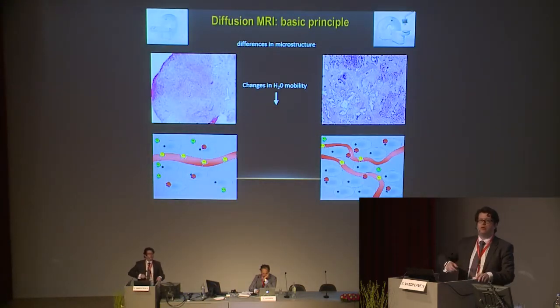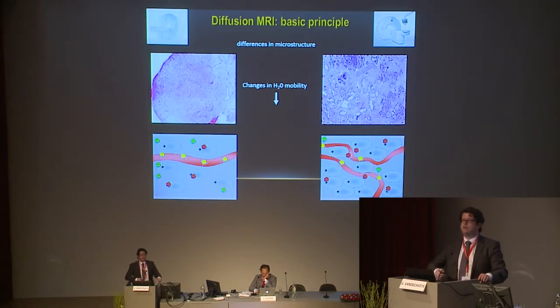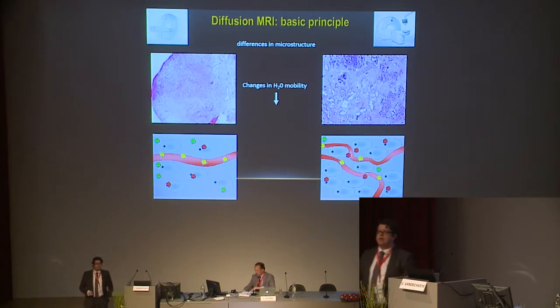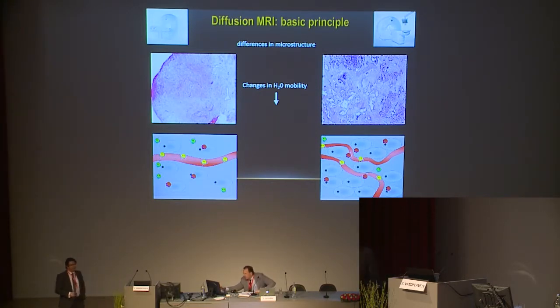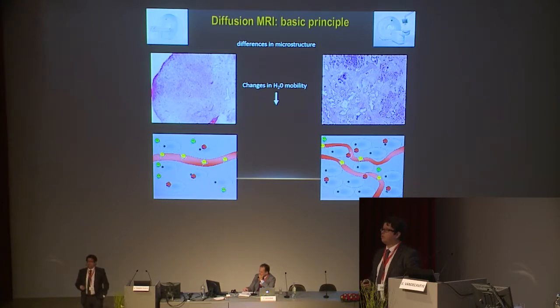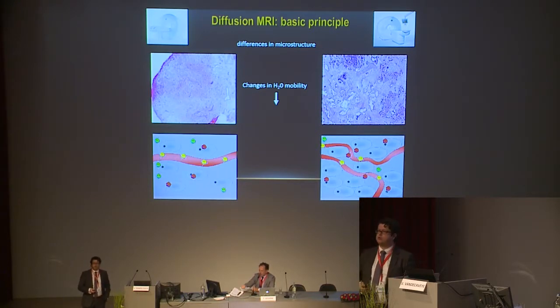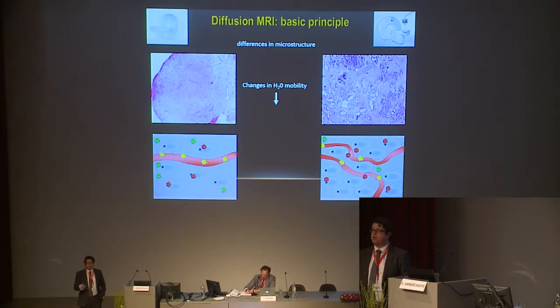Diffusion MRI, although in use already for a long time, is often the noble unknown person in imaging. How does it work? Well, very importantly, you don't need a contrast agent for it. Actually, the technique was used for the detection of acute brain infarction. What diffusion MRI does, it measures the differences in the movability of your water content. It actually measures changes in the Brownian movement, or random movement, of water molecules, which is everywhere, in your body, a glass of water. So let's put it simple.